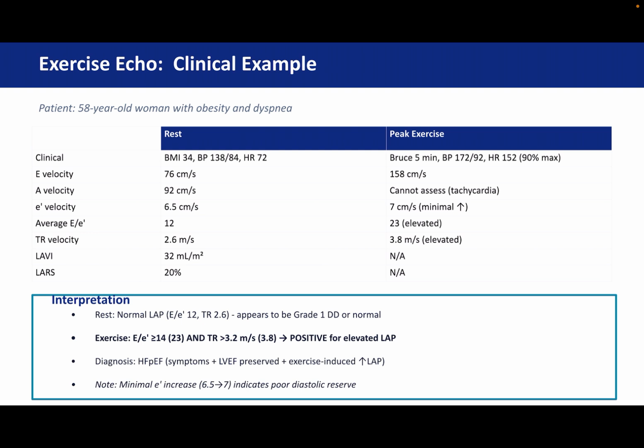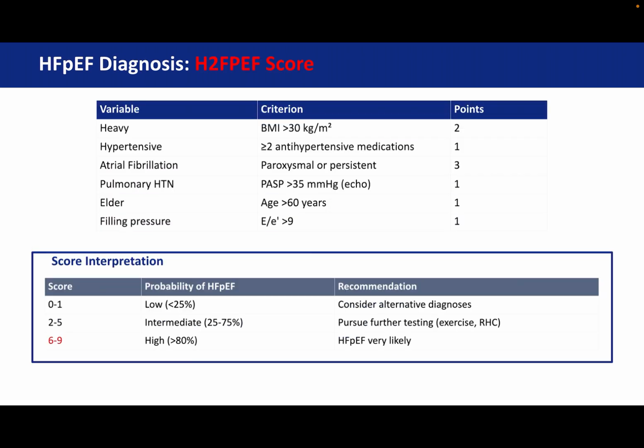Both criteria are met, therefore this is positive for exercise-induced left atrial pressure elevation. Diagnosis of heart failure with preserved EF. Symptoms are from exercise-induced elevated filling pressure. Heart failure with preserved EF diagnosis.